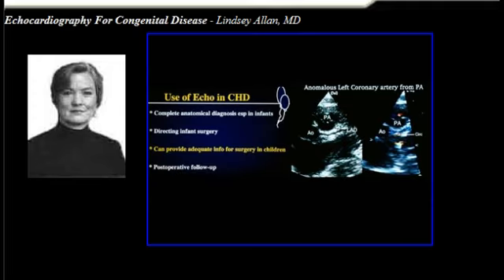Now, the next use of echocardiography is to provide adequate information for surgery in children. Now, in later childhood, not the neonatal period, but in later childhood, cardiac catheterization is safe. In general terms, you're not wanting to avoid it quite so desperately as you are in the neonate, or quite as importantly as you are in the neonate. But in many cases it's not necessary, and you would prefer to avoid this unnecessary test if you can.